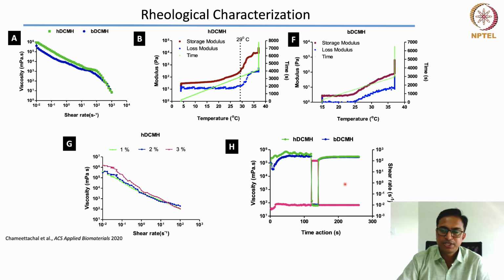When we adjust the pH to 7, it becomes a temperature sensitive material, because of the high amount of collagen, it can behave like a self assembling material and can become a gel.